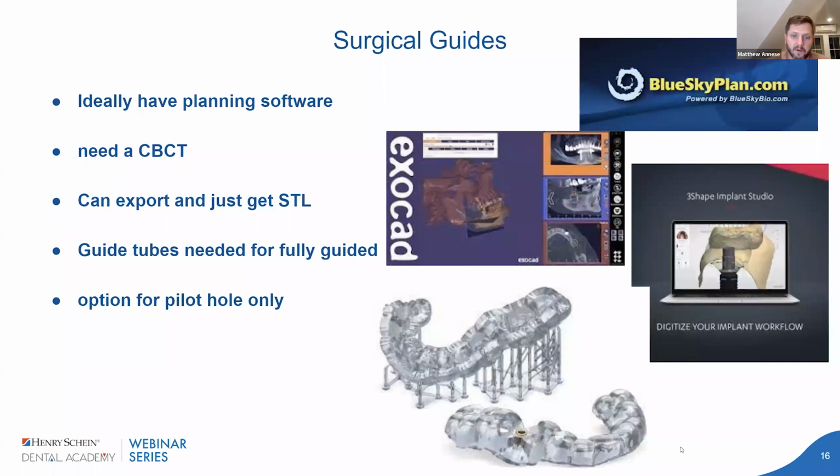I'm more implant focused. I've done thousands of implants. So it's basically to get me started, make sure my angulation, orientation, and spacing are right, and then I can take it from there. You can print these for $2 to $3, versus I remember paying like $250, $270 for surgical guides back in the office.